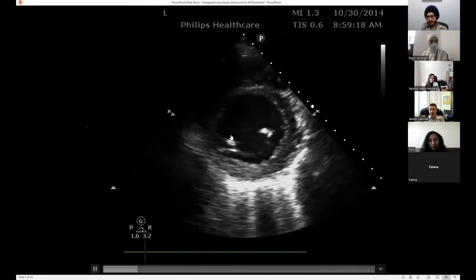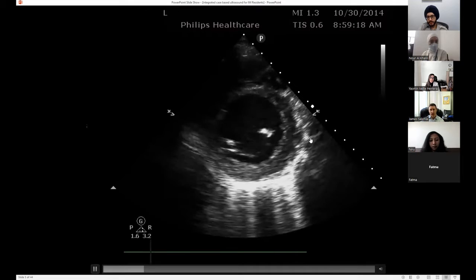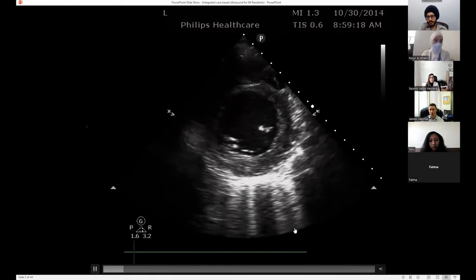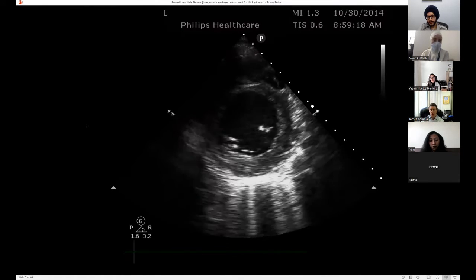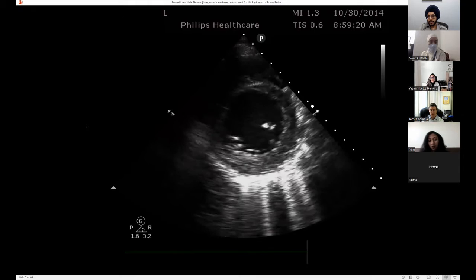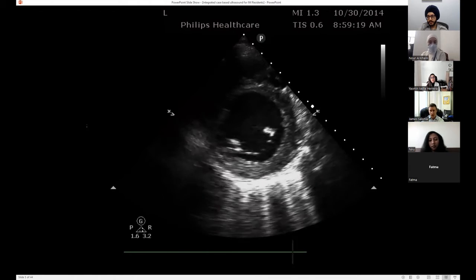They're like boxing gloves is sometimes what we talk about it, right? Just to familiarize ourselves. And we're having a good view of the myocardial wall and the endomyocardial border as well. So we can tell a lot about the ejection fraction here. So what do we think of the heart function in this view? This decreased LV contractility or LV function. Yeah, I agree with you.